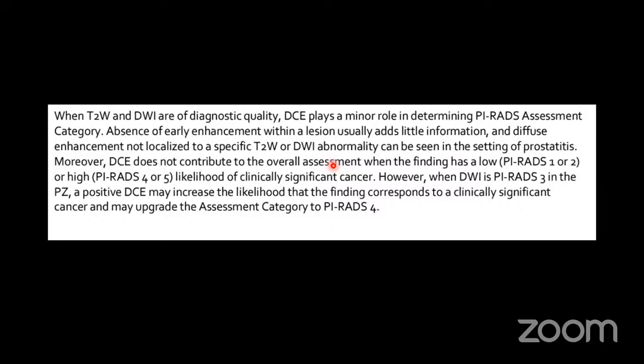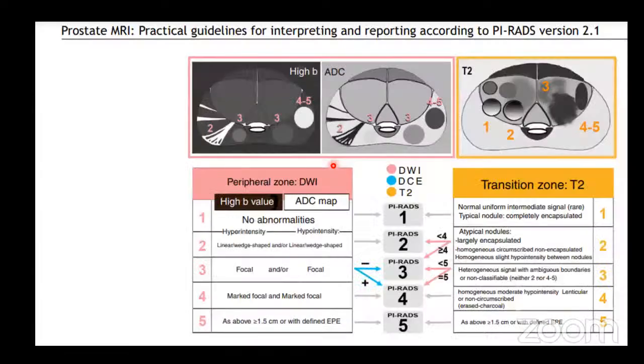So that was about how the version 2.1 document described the utility. And now let's move on to a graphic depiction of various descriptors. So this is the most important kind of diagram which somebody who is doing or reading multiparametric MRI often uses, and those who are just starting can start with this or revise this often. It's all condensed into one.